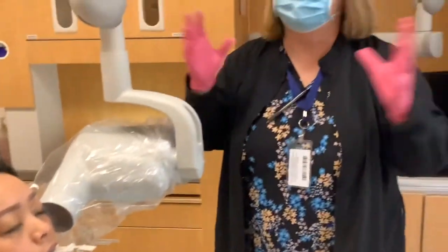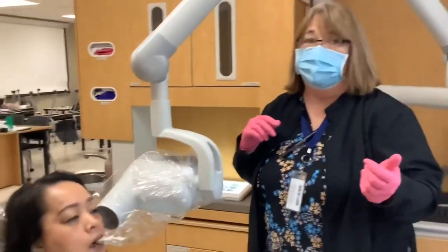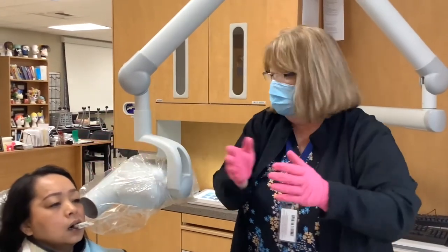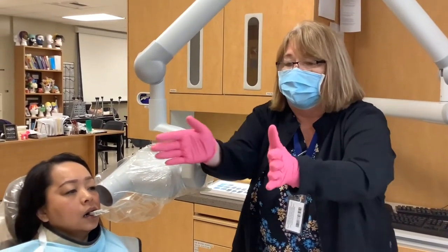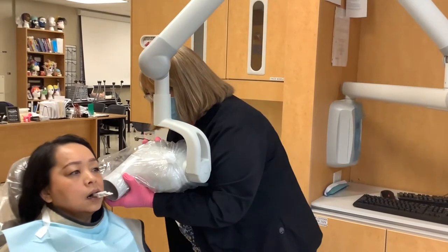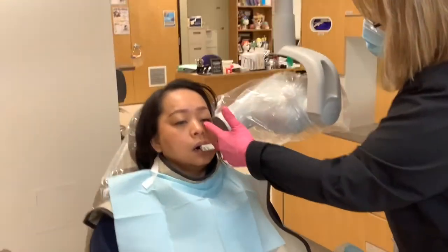The x-ray beam is an invisible beam — you will never see it, so you have to visualize. Pretend like the x-ray beam is water coming out of a water hose. When water comes out of the hose it sprays, and so does your x-ray beam. I have to visualize where my beam is going to go to cover all my film and all my molars. With this angle, I've got it lined up — my beam is coming out and it should get my shot.